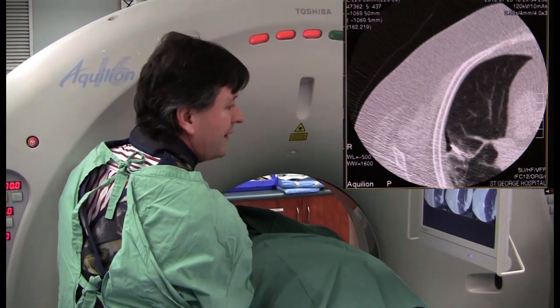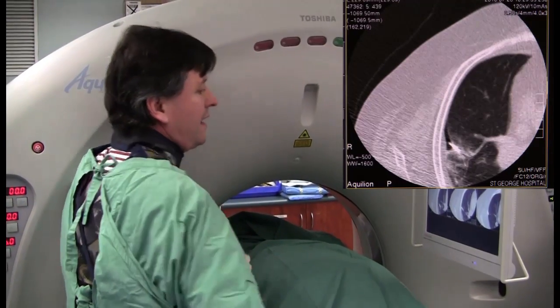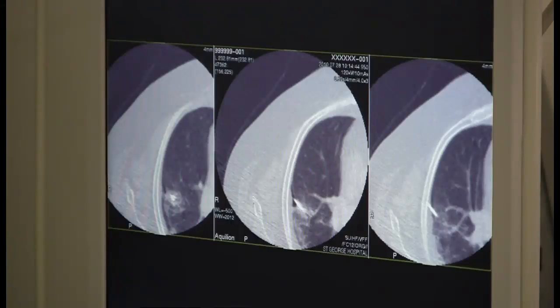What you've seen today is the use of the fluoro CT system to place a radiofrequency ablation needle into the nodule. Apologies for some of the video sync which wasn't quite spot on — this is our first video, but I think you get the idea. Our other videos will cover more of the technical aspects of fluoro CT and how to actually get the needle steered exactly into the spot you want. Low dose, no dose to the operator's hand, low dose to the patient, quick and accurate.